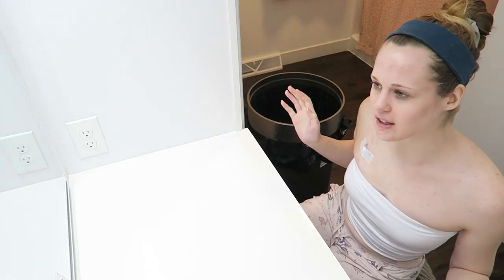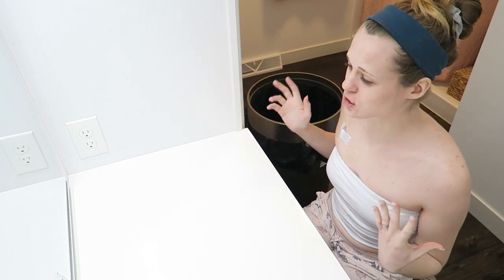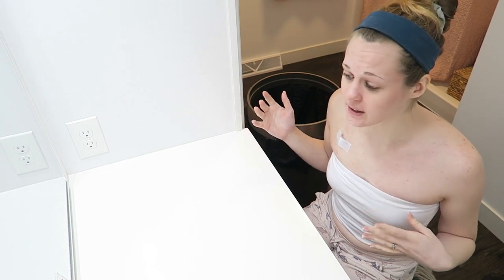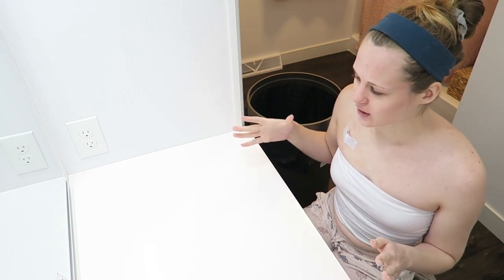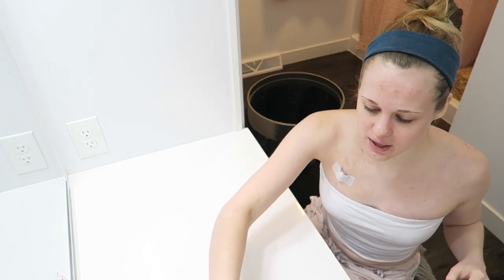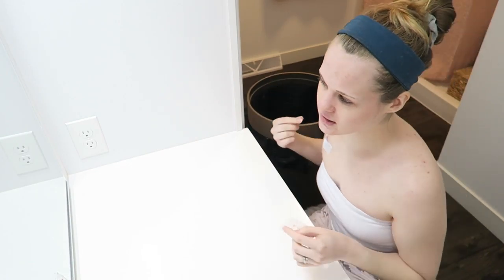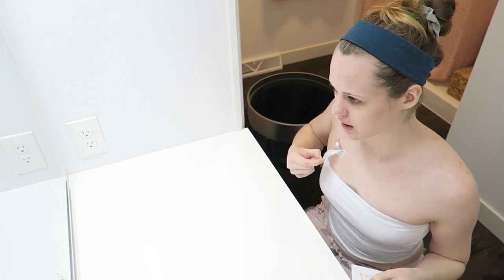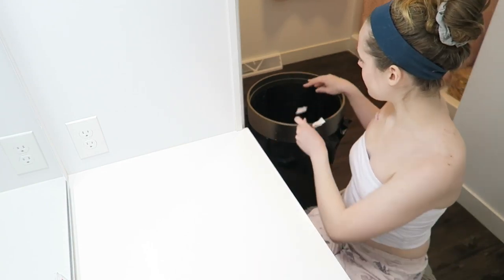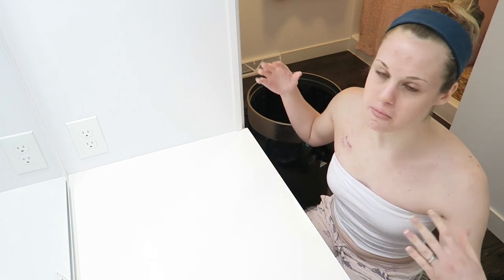So this angle's gonna be a little bit weird, but because of my bathroom setup, it's the best I can do. I will try to eventually get a better video with a better angle once I have a better setup where I can put the camera across from me versus above. Now I'm gonna go ahead and grab an alcohol pad and take off the Emla cream. Okay. There we go. We don't have to make it super clean because we are going to clean the area very well.